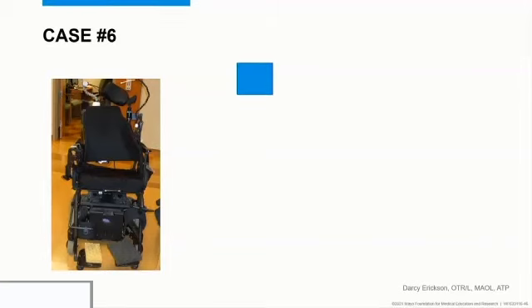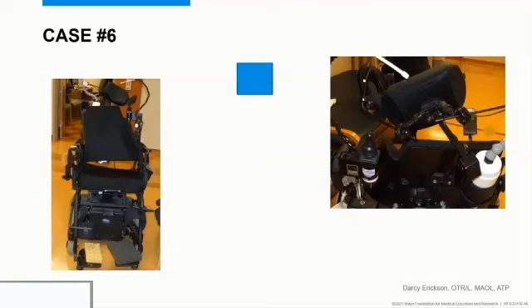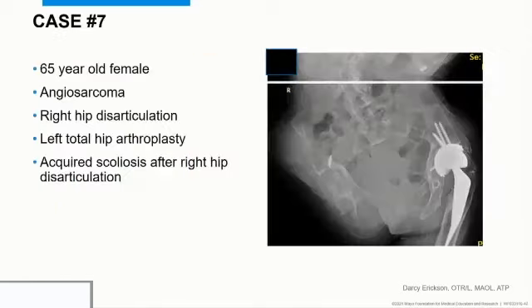I mean, it doesn't look great without him in it, but it's what he needed based on how his body was built. So we actually took very similar dimensions towards his new chair, and he was so comfortable in that new chair. It doesn't look like it should look, but it was very functional for him. And so again, it's not about us and what we think it should be. It's as much about what the client needs and how they interact with it, and then me doing my best with all of my friends and help that I need to try to match what they need with what is possible and what's out there for us to put together.